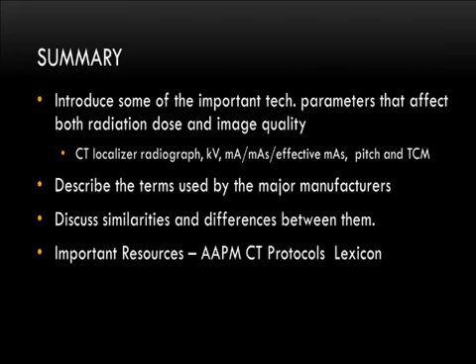Certainly we think about this differently for pediatric patients just because we want to be very aggressive there. But I think that's what you were getting at, that you want to change it by indication and by image quality, not necessarily to adjust for patient size. That's what the system should be doing for us.